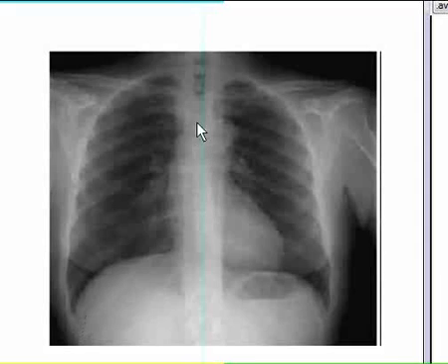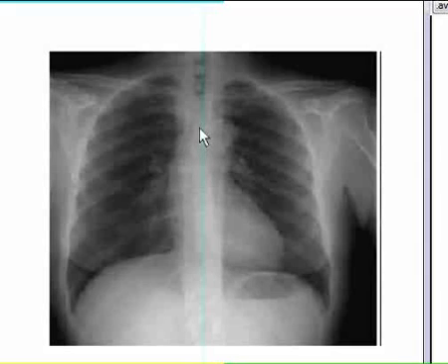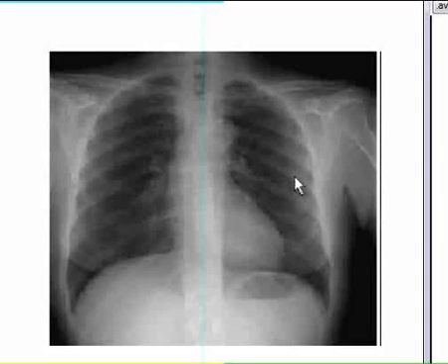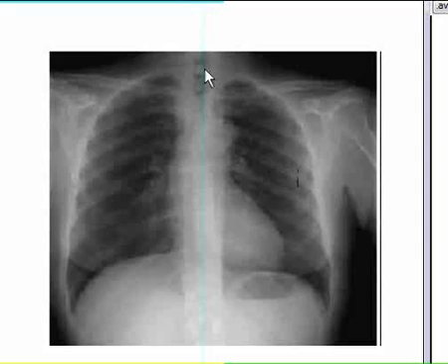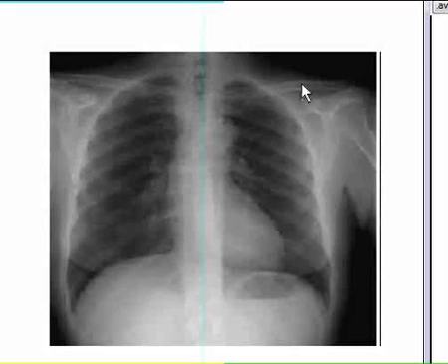So this black line is the trachea, and apparently this is the carina here, and the trachea is dividing into the right main bronchus and left main bronchus. These are ribs — posterior ribs. You can see the thoracic spine as well. And these two bones are clavicles, or collar bones.